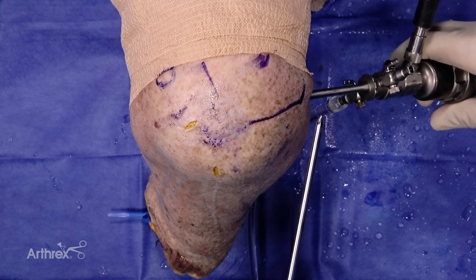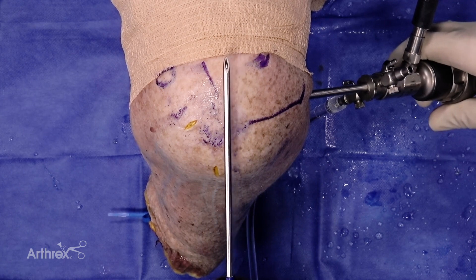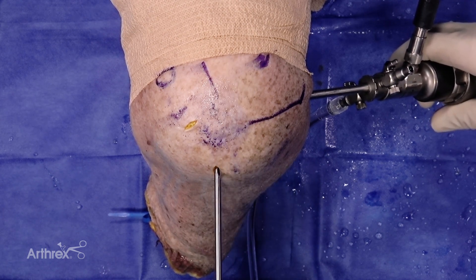Hi, this is James Gregory from Houston, Texas. We're going to be going through bursal re-implantation using GraphNet technology during a rotator cuff repair.